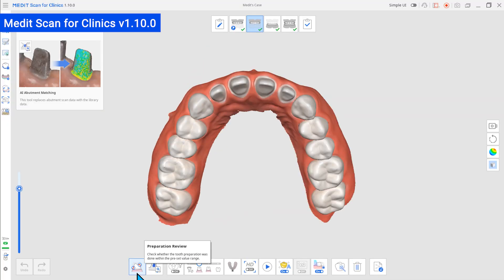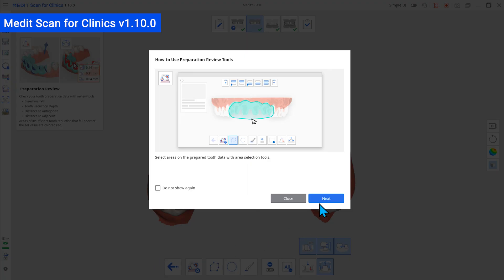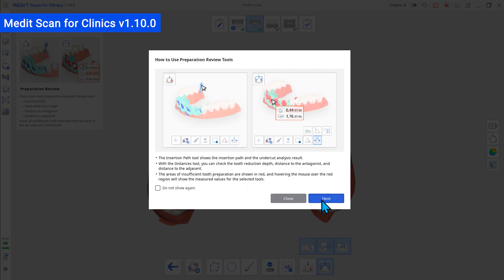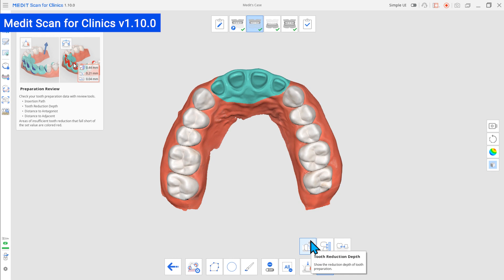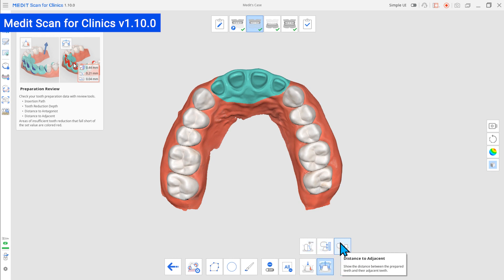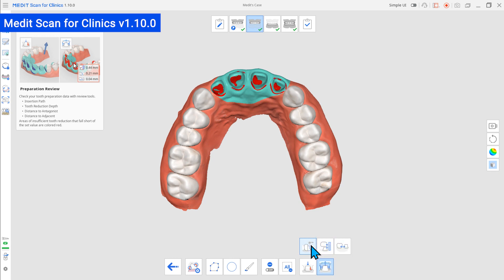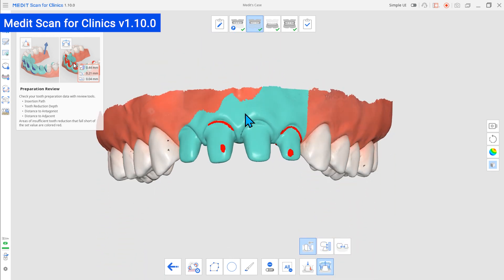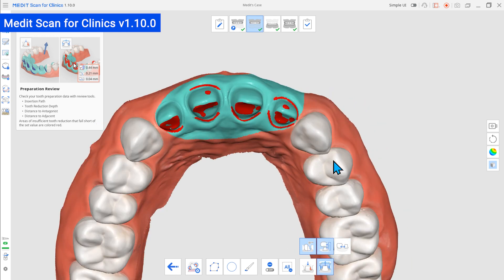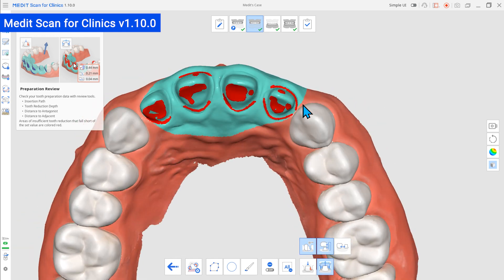With this new feature, you can now ensure proper tooth reduction before prosthesis fabrication. Depending on your required data, you can check the insertion path, amount of tooth removal, and distances to the antagonist and adjacent.